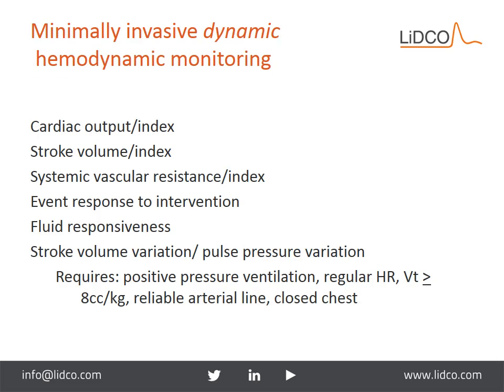So what is minimally invasive dynamic hemodynamic monitoring, or sometimes referred to as functional hemodynamics? Well, as you can see there on the screen, cardiac output, index, stroke volume, systemic vascular resistance. These can all be measured beat to beat in real time, meaning that as the patient is experiencing the changes in these parameters, you can also see them on a screen.